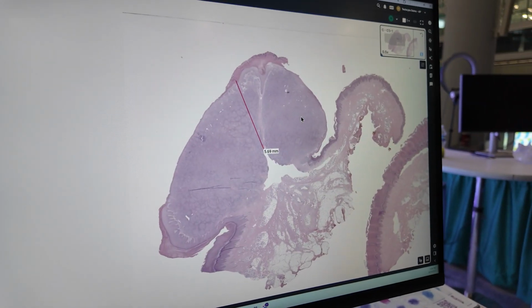Yeah, so this is the general overview of our new product Fusion. There are way more features that I haven't shown today that I would love to show if you have more time next time, or if anyone is interested in a more in-detail demo. We can go through this in detail, and hopefully this works for your clinical workflow. We understand labs are so different, pathologists are different, and we wanted to build a product that was flexible for all different kinds of users.